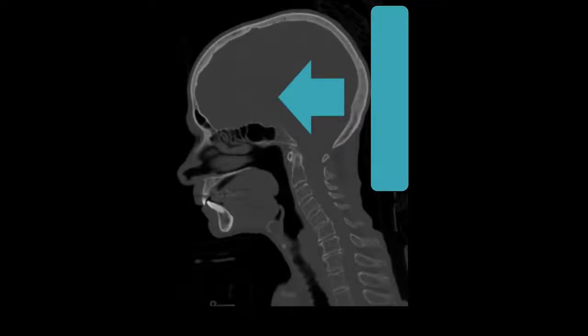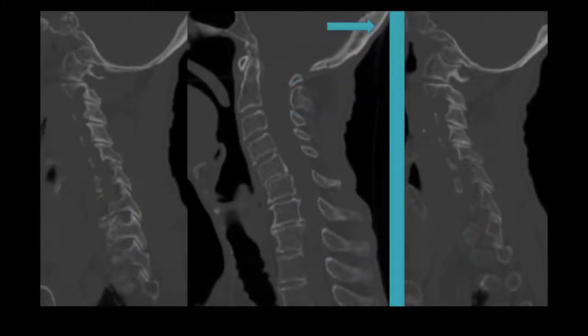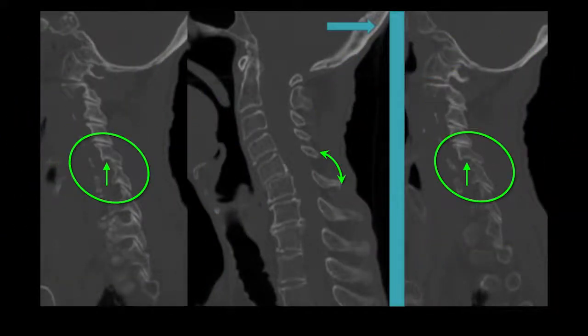There is a pillow or a pad or something under the patient's head. When you look at the parasagittal views, which is probably one of the most important views to be looking at in your cervical spine, what do we see? We see a little bit of interspinous widening in the mid-sagittal plane there, and on the parasagittal planes, there is offset. Okay, so the question though is, is this positional because the patient's head is abnormally flexed a little bit, or is this a real injury? And it's not easy to answer, and that's why I won't scan these patients with pillows under their head. So we repeated the study, took the pillow away, put the head back down flat onto the table, and we see that there is persistent interspinous widening and persistent uncovering of these facets. So this is a true hyperflexion sprain injury.